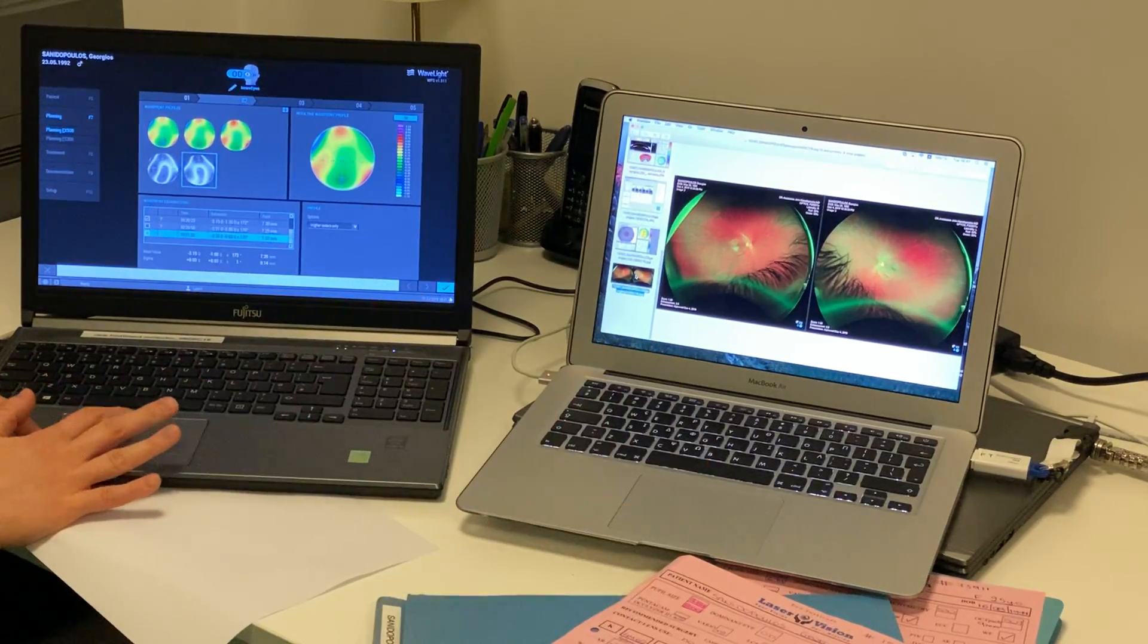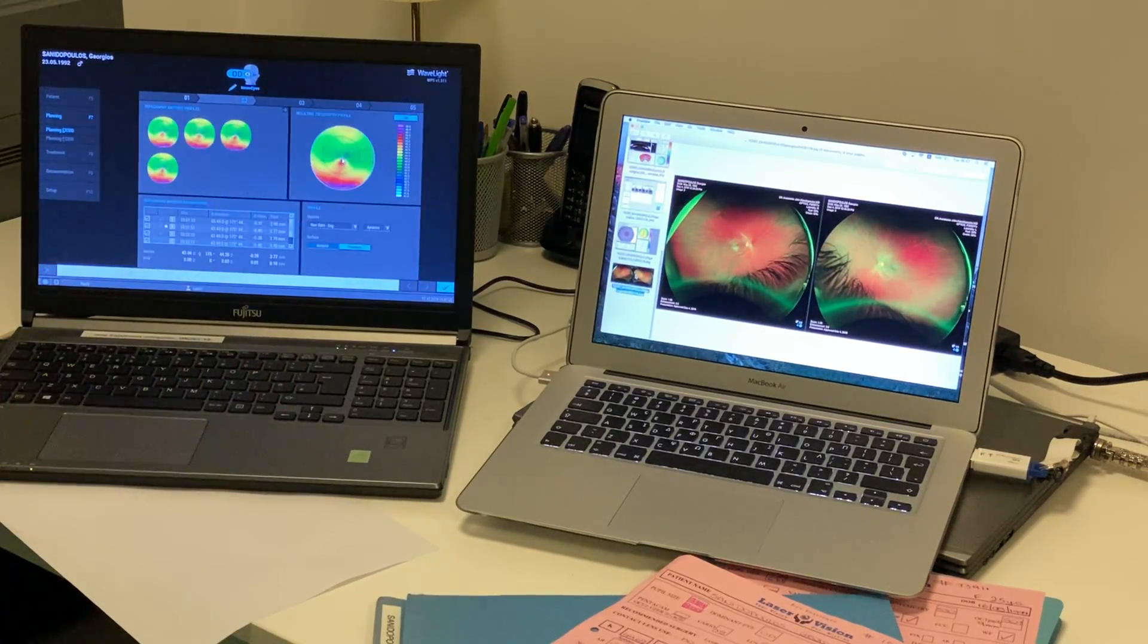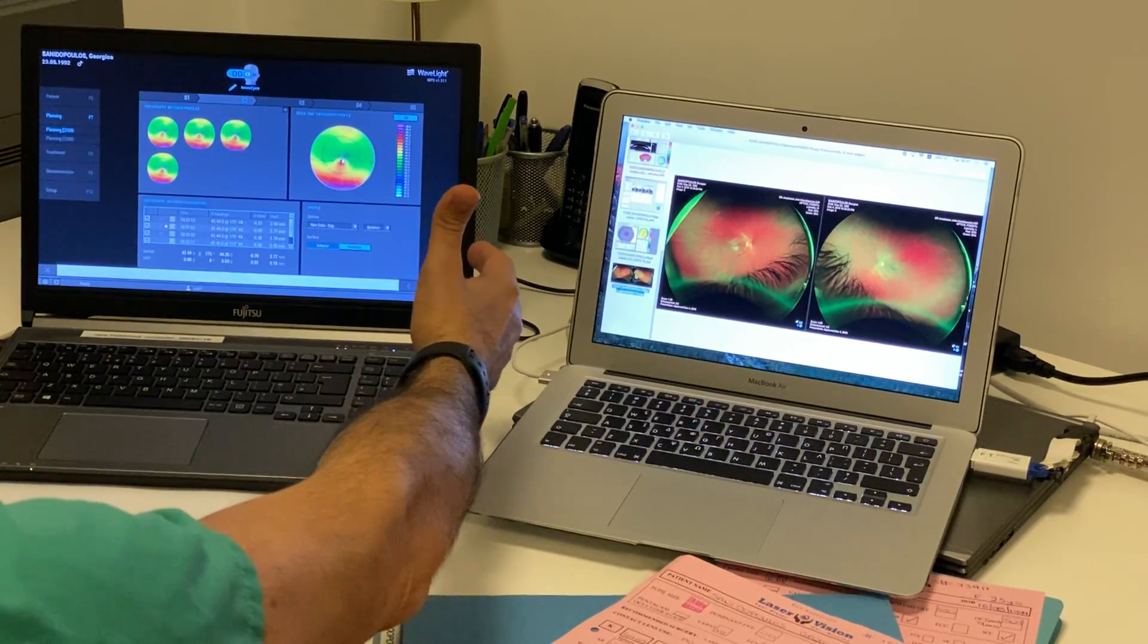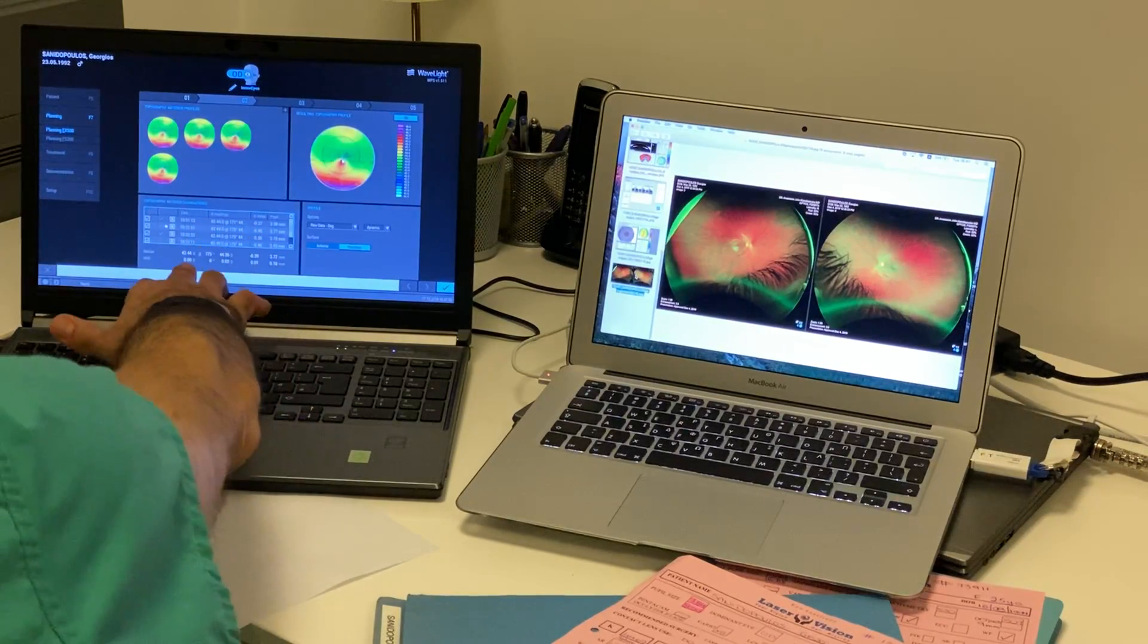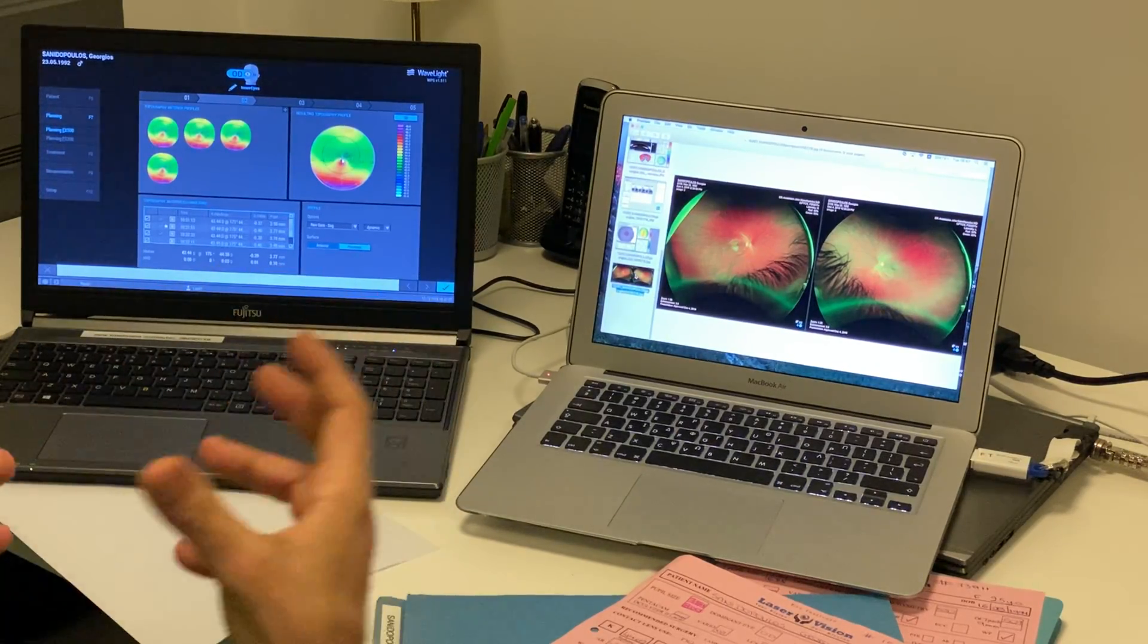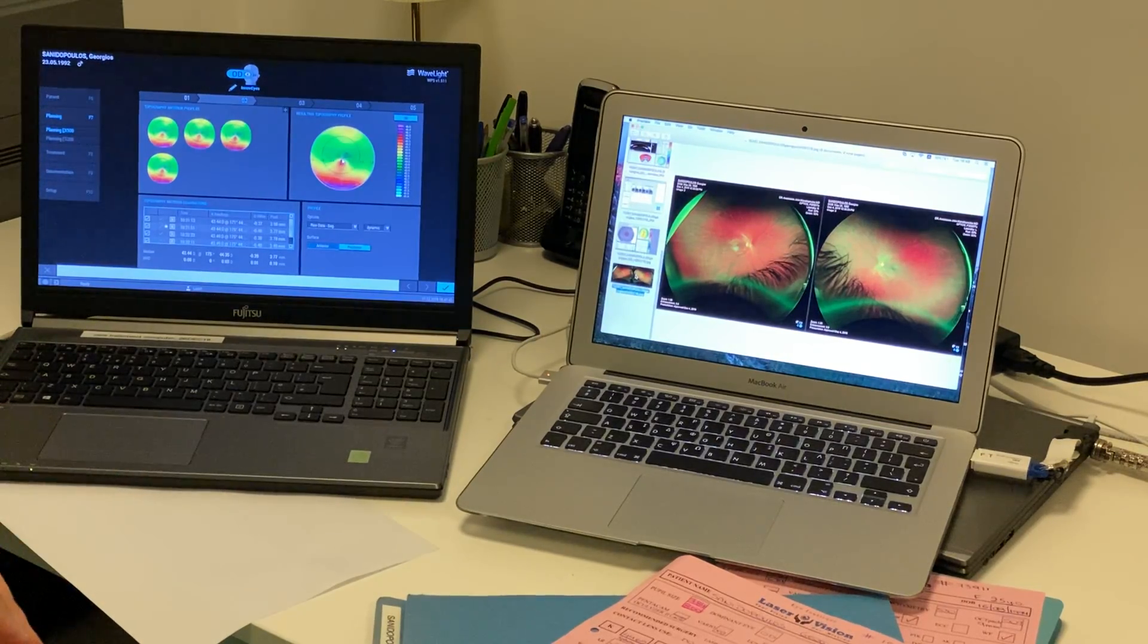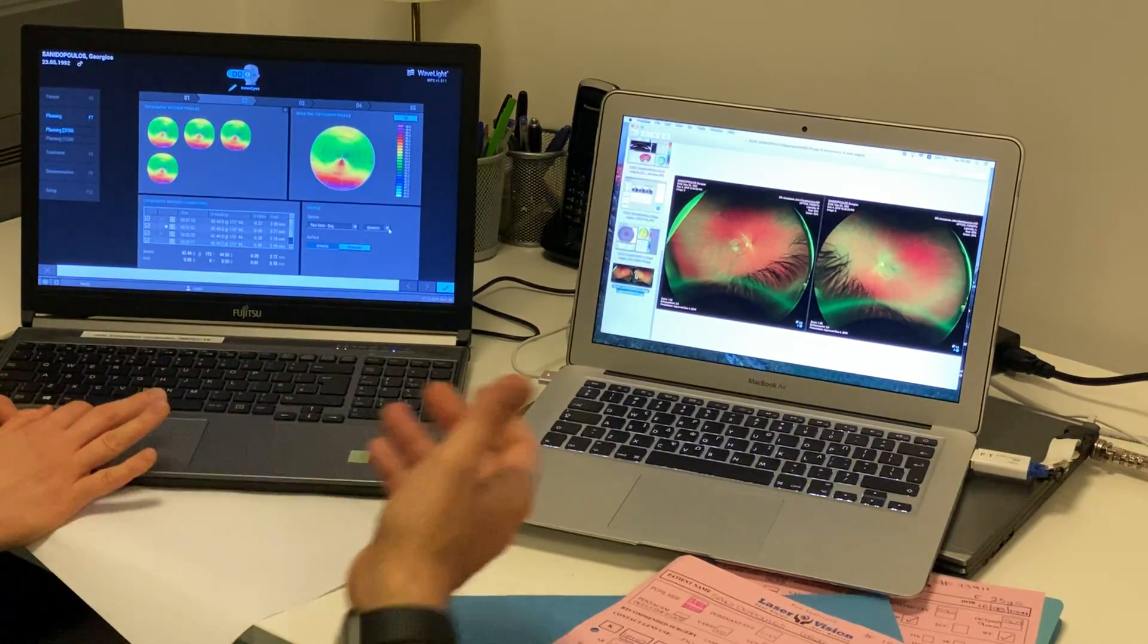Then we'll skip, once we have very consistent wavefront maps, we'll skip to the tomography assessment, the Scheimpflug Tomography. This is a complement to our team here in Athens. The deviation between these four tomography measurements is zero. So we have basically measurements that are identical, and we have described in the past several techniques on how to achieve that goal with accurate and careful measurements.